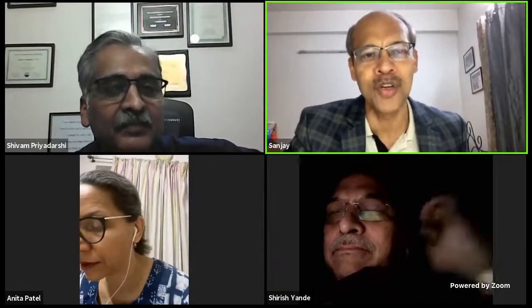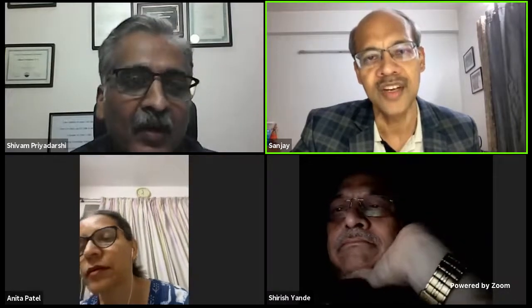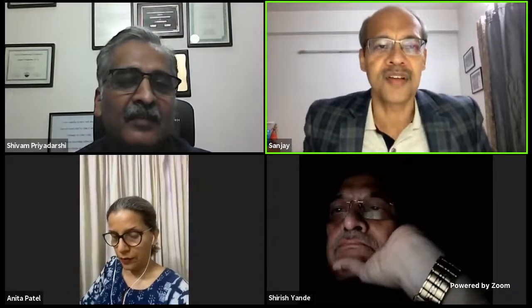You have to be patient, and when you're doing this, you can't put a time pressure on these children. That really makes it very difficult. So your technician should have that patience. Actually, we have 2 urodynamics machines in 2 adjoining rooms, and so we can manage these kids and all. Otherwise, it's very difficult in one day to handle the volume that we have. So with children, you can't have a time pressure.